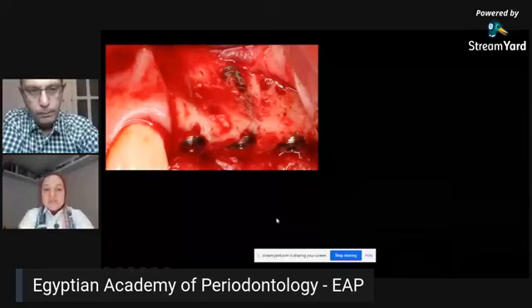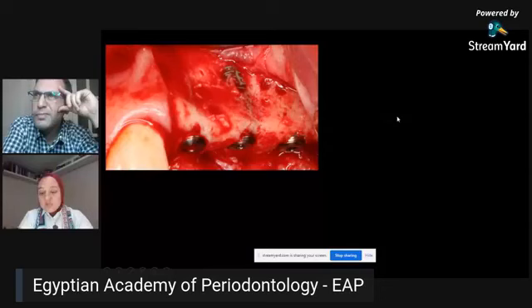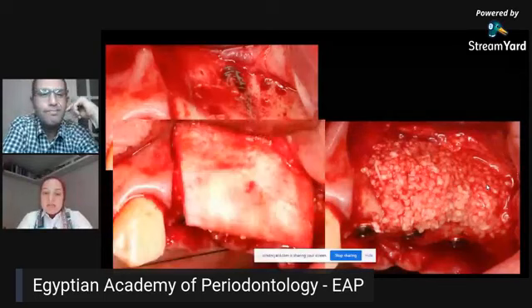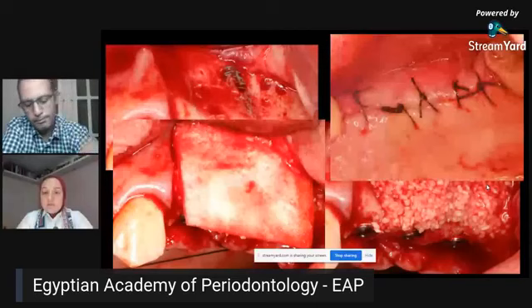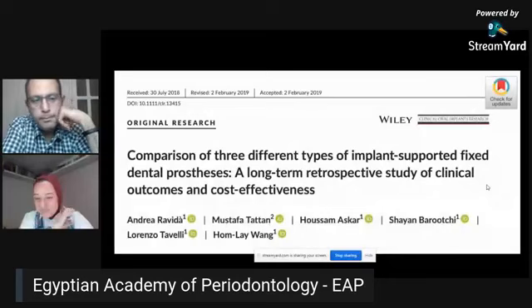Here in the middle implant, we had a fenestration defect and very thin bone on the crestal part and a crack here. We also knew that this would happen from the x-ray, so we prepared our graft material and collagen membrane, and we placed the graft and the collagen, and we sutured it. And then we opened after 6 months for the prosthetic part. Unfortunately, for most of the cases, I don't have my crowns, but I will make sure to get the pictures, because usually the prosthetic department continues the work.